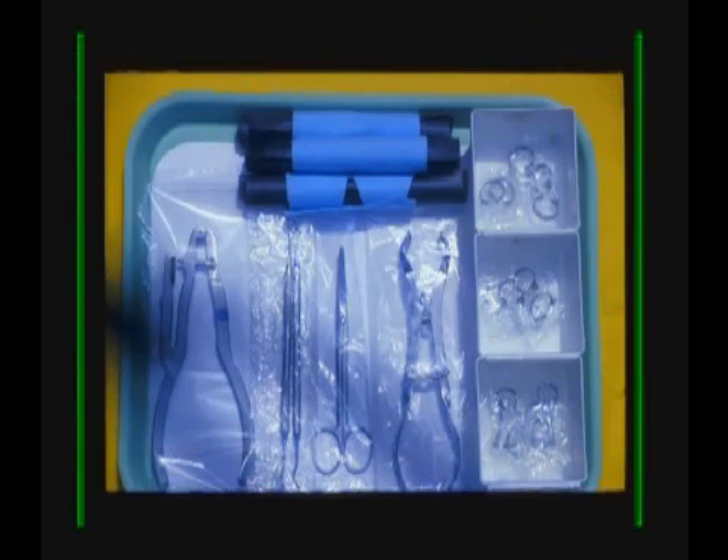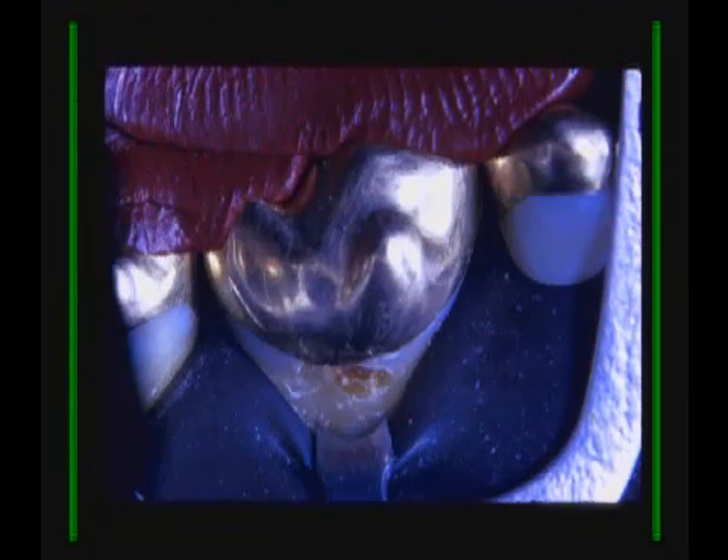Here is our tray setup. All of our clamps are individually packaged and sterilized. Here we have lingual or palatal decay of an upper molar. We have half of the 212 that's embedded in the compound and it gives us beautiful access.